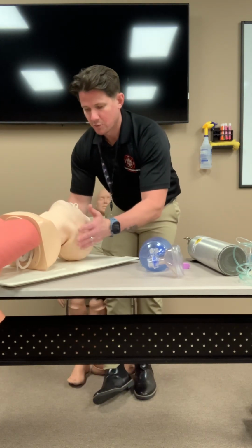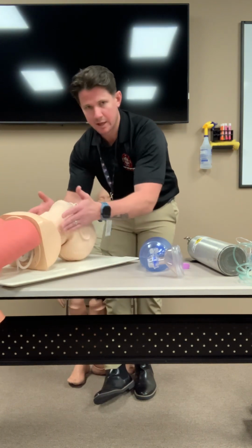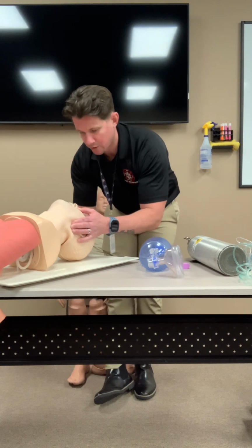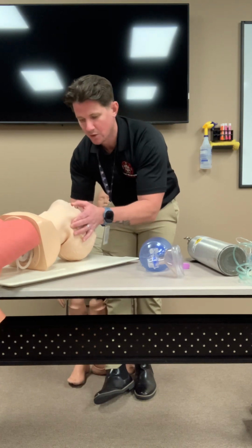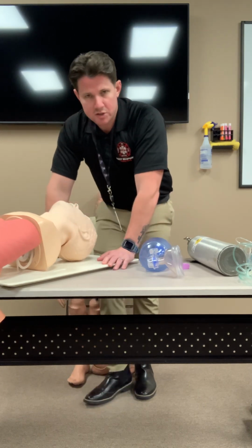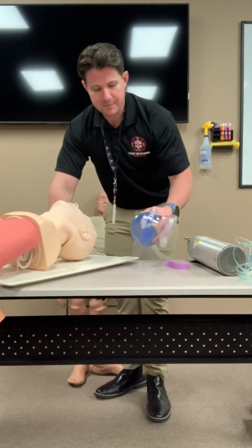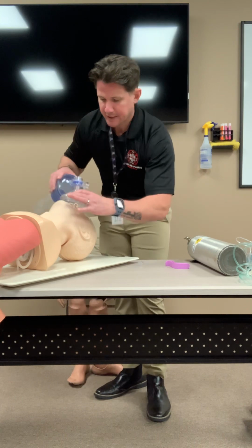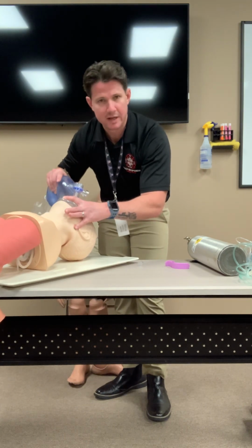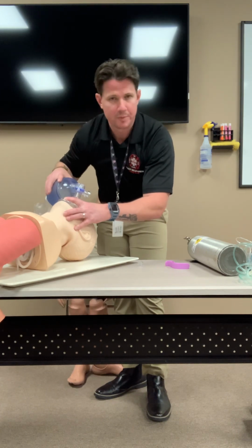So, point is, we're gonna use the sniffing position, inline stabilization, open up the jaw with the jaw thrust or the head tilt chin lift, and we're gonna look in the airway for any secretions or possible oral airway obstructions. No obstructions noted. At this time, I'm gonna grab my BVM. And again, for about the first 30 seconds, it is okay to administer breaths without oxygen or an OPA, right?